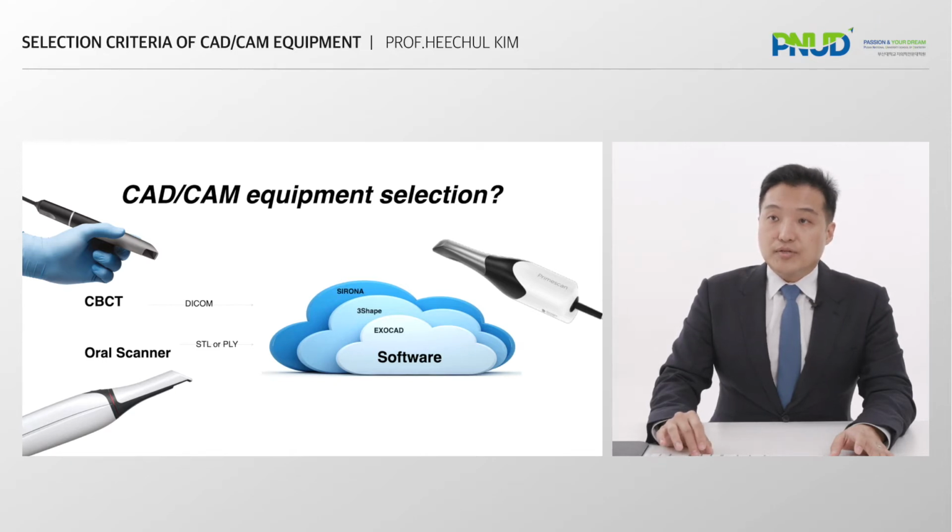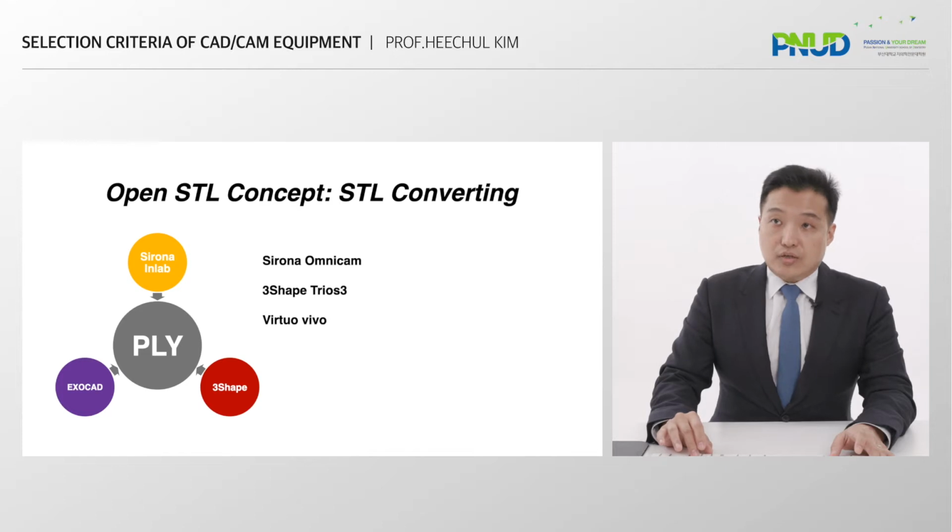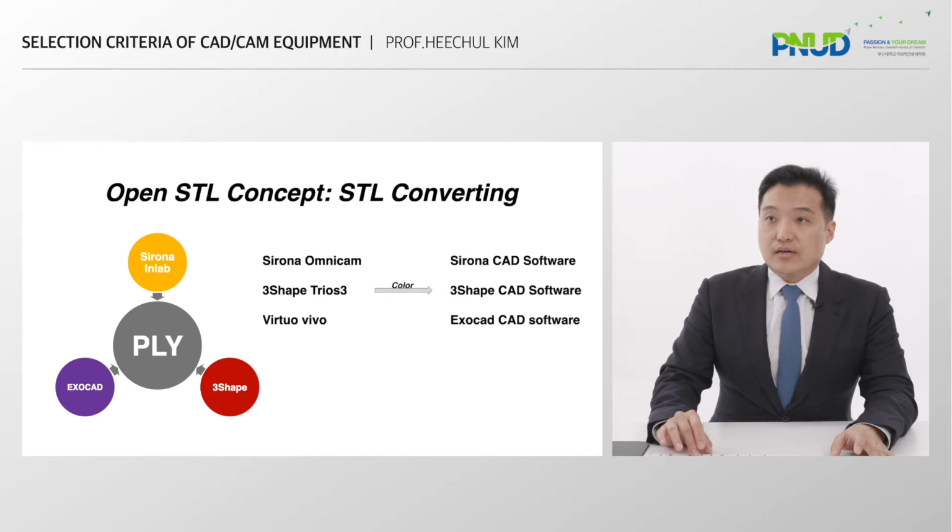The CAD software is a very important part because the software selection is equivalent to selecting the treatment method. In the CBCT, the DICOM has been in use for a long time, but the intraoral scanners' STL and PLY is still fairly new. The STL and PLY file conversion recently arose when Sirona's intraoral scanners began supporting both files.